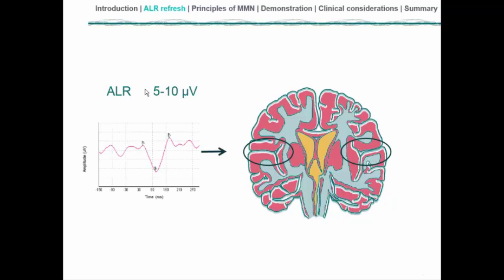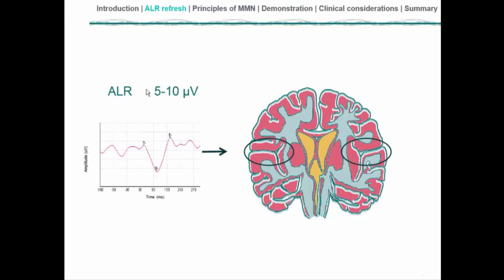The change in the acoustic environment that triggers an onset response like this N1P2 complex can be a change from silence to sound, as occurs in typical clinical measurements where transient sounds such as beeps are played, or it can be an onset of silence in otherwise persistent sound, or it can be one ongoing sound which abruptly changes to another.